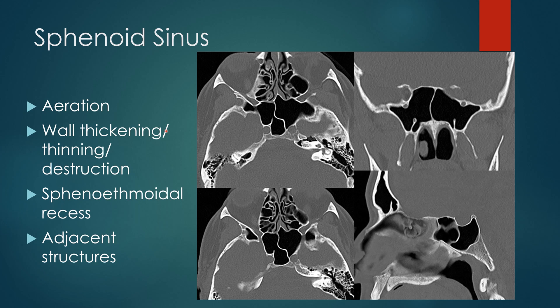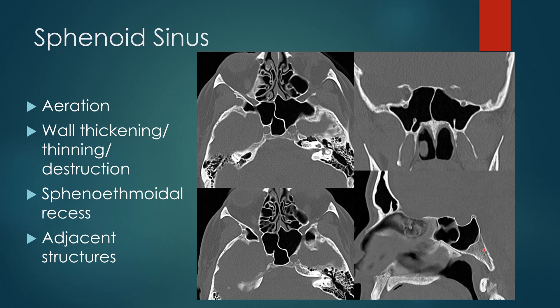For the sphenoid sinus, you discuss the degree to which it is aerated, whether it contains fluid with a fluid level or meniscus, whether there is mucosal thickening or polypoid focal mucosal thickening, and you evaluate for wall thickening, thinning, or destruction. The sphenoethmoidal recesses are difficult to see, but there is drainage of the sphenoid sinus into the posterior ethmoid air cells, so significant sphenoid sinus disease is often associated with posterior ethmoid sinus disease. Remember, when you have a disease process involving the sphenoid sinus, you have very important adjacent structures at risk: the internal carotid arteries, the sella — which is intimately associated with the sphenoid sinus — the clivus, and the basilar artery sitting right behind the clivus.